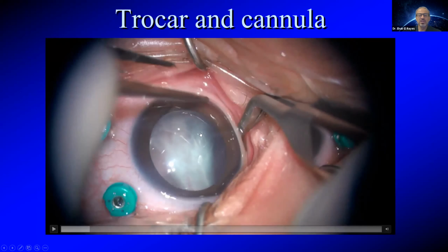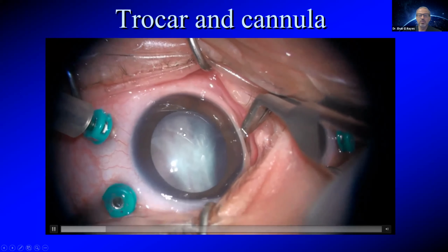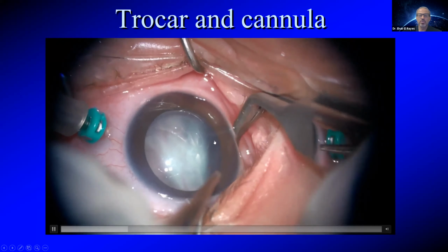He has anterior retinal dragging, but the lens is touched by the retina right here. But there is some clear areas. So before I attempt putting my cannula, I'd like to indent all around first. I'm deciding to go 1.5 or 2 millimeter behind the limbus, but in which quadrant do you put your infusion? It's very important if you're planning doing lens sparing vitrectomy. So I'd like to indent like this. Then when I find the correct quadrant, I can put my instrument here.